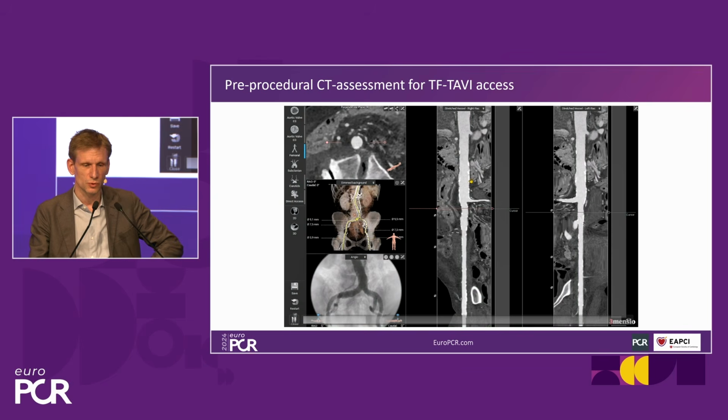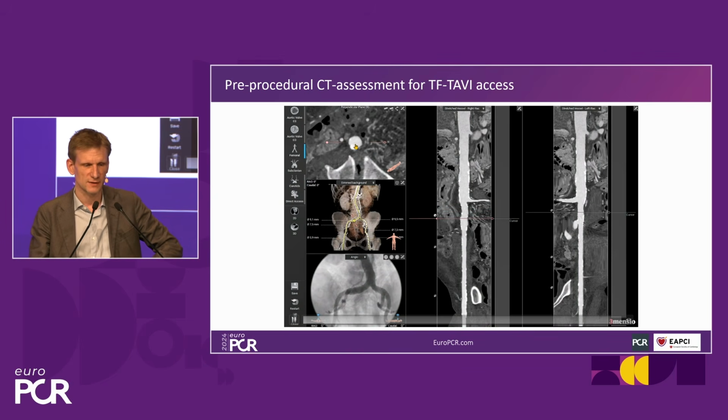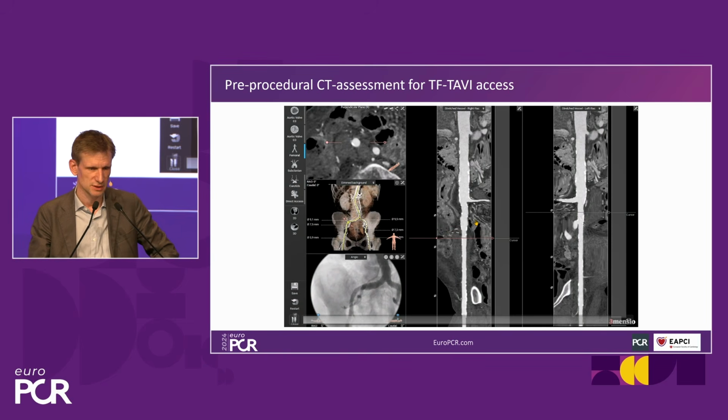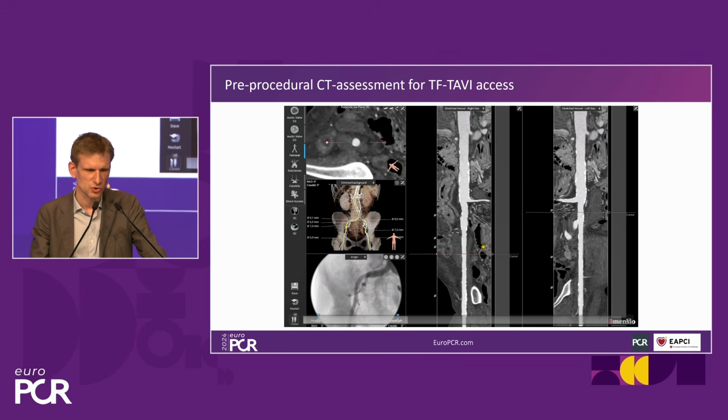So that's one thing. The second thing is you walk through it. You want to see if you have roughly more than 5 millimeter. For most of the TAVI devices, a 5 millimeter intraluminal diameter, however much calcification there is. You screen for this up front, pre-procedurally. You look at that on the CT. Here, for example, there's a little bit of calcium, but the size is definitely big enough. It's 6.3 millimeter. That's no issue whatsoever. I keep on scrolling down.